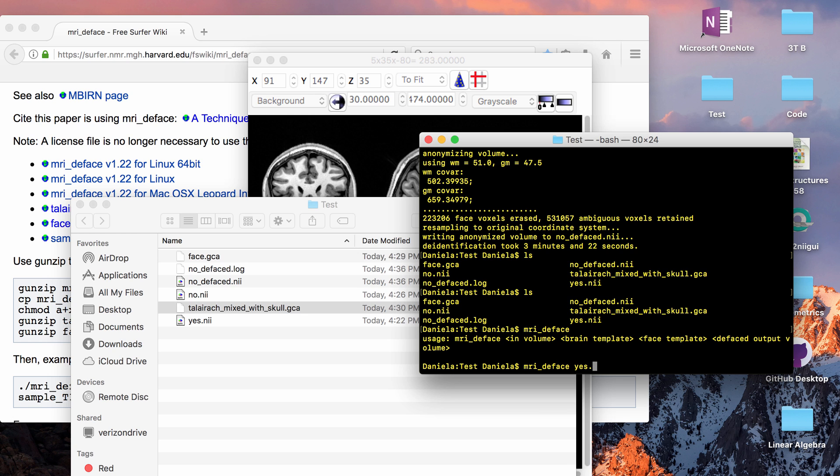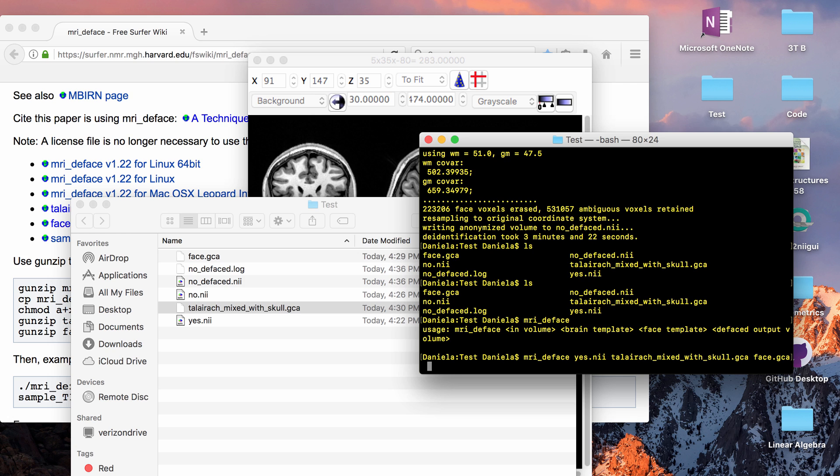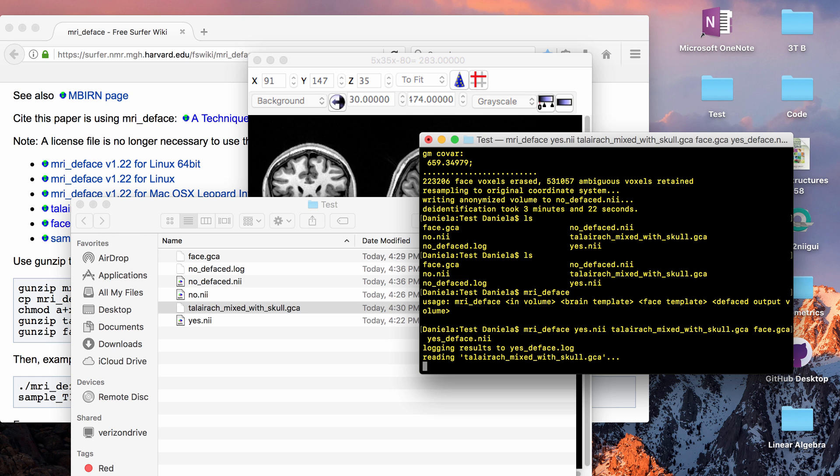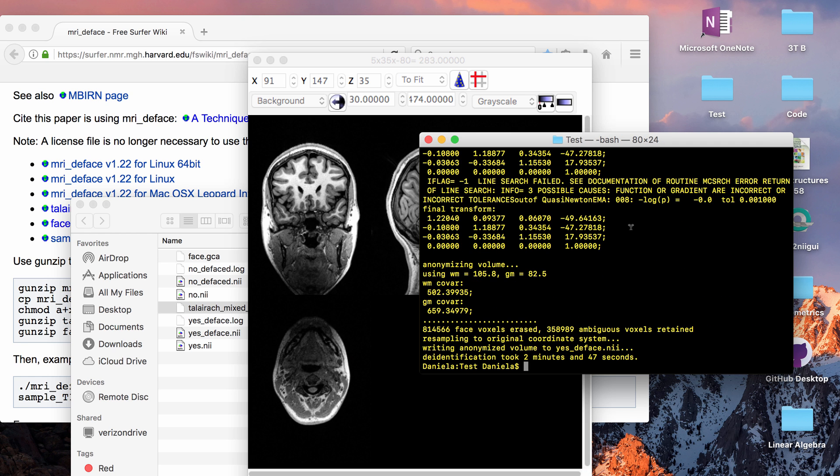So I have yes dot nifty, the brain is that, then the face, and then the output is gonna be yes defaced dot nifty and that will just take a couple minutes to run.